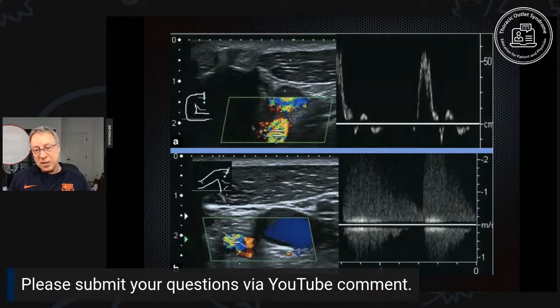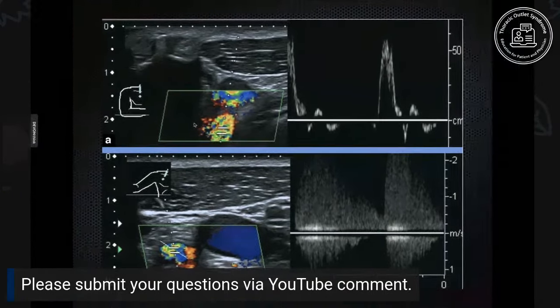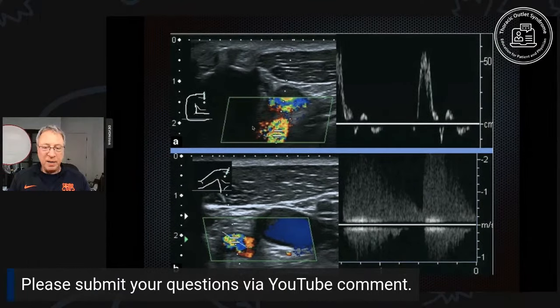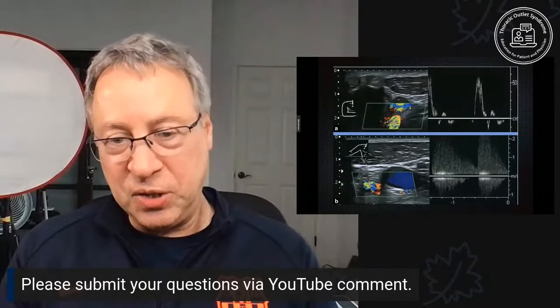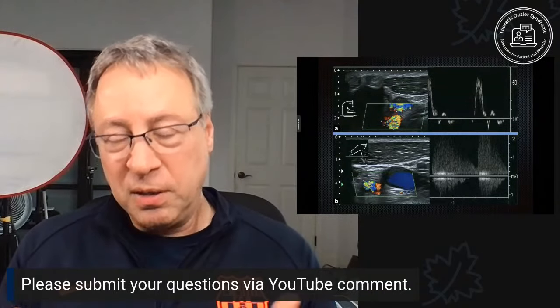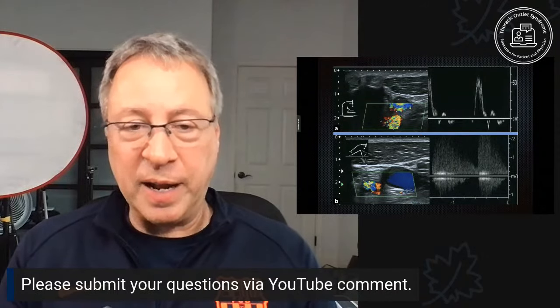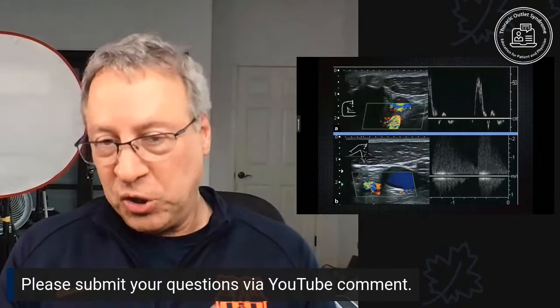The only problem is this. We're seeing the artery being compressed. Does that mean the brachial plexus is compressed? No, we don't know that. And ultrasound, since it's blocked by bone, cannot see into that space between the rib and the clavicle, a very important space. So if you can't see that, you're taking secondary information like this and going backwards and judging whether the brachial plexus is being compressed because the artery is. Well, we don't know that. And I can tell you from my experience, compression of the artery does not equal compression of the brachial plexus.